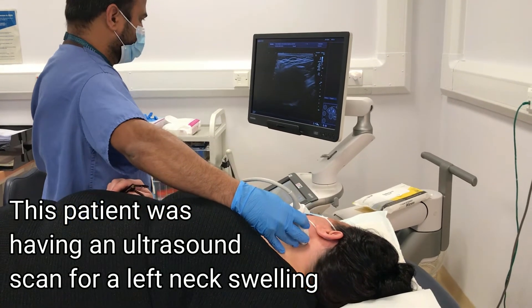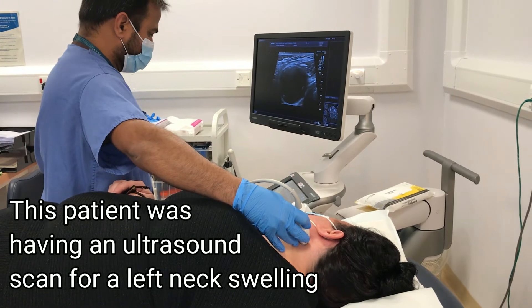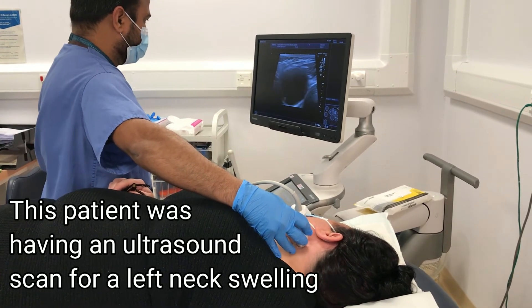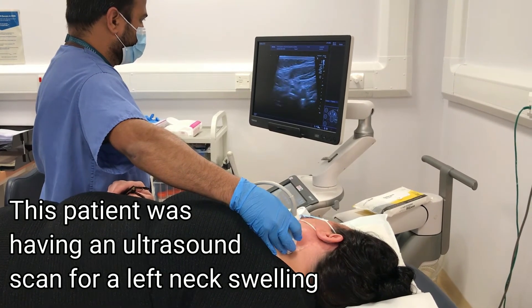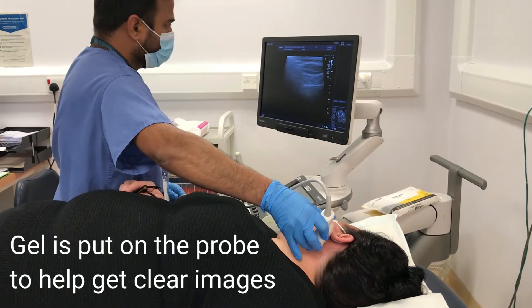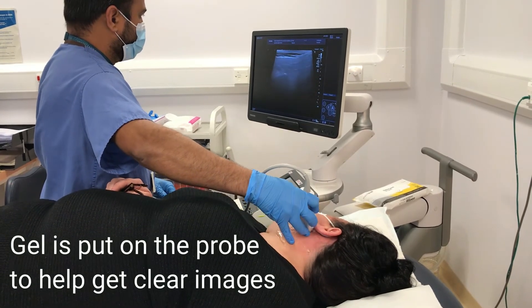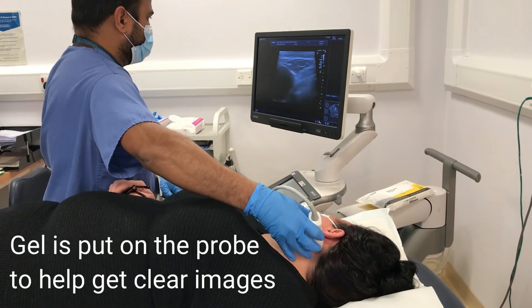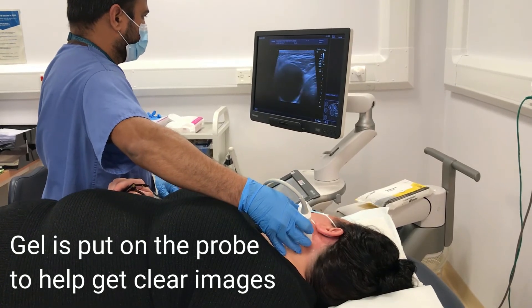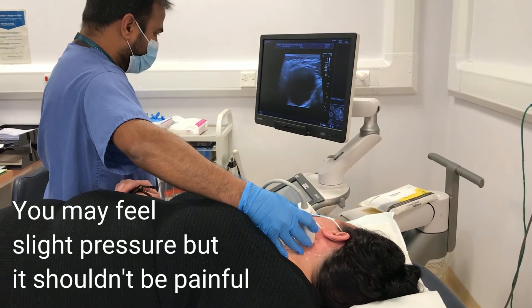When you first get through to the ultrasound room, the clinician will go through the procedure with you and make sure that you are comfortably positioned. This patient was having an ultrasound for a swelling in the left side of their neck. Some gel will be put on the probe, which helps get clear images of the swelling. This can feel a little bit cold. The procedure itself shouldn't be uncomfortable, but you can sometimes feel pressure over the area.